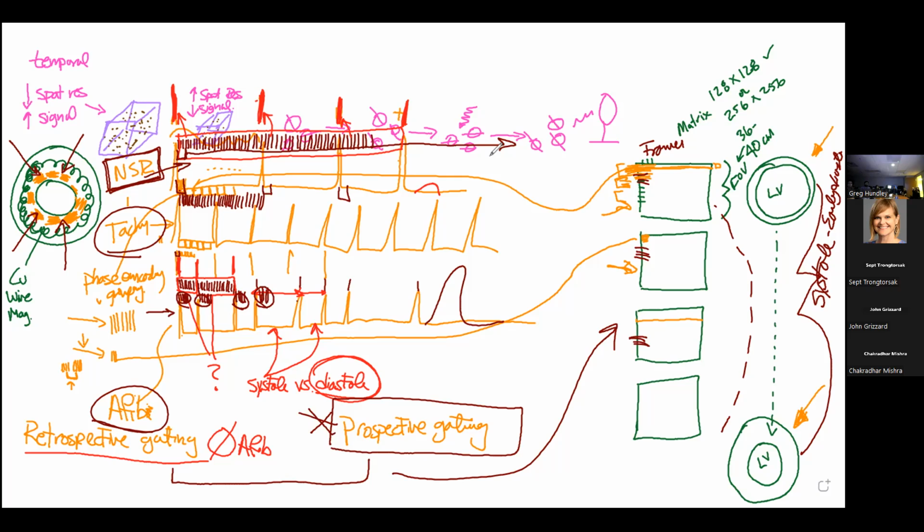So we've talked about normal sinus rhythm. We've talked about tachycardia. We've talked about irregular rhythms. All of this is now to balance, in addition to earlier, we've been talking about spatial resolution and signal. The new factor that we've got to add in is temporal resolution. So it's constantly a balance when you're acquiring studies.